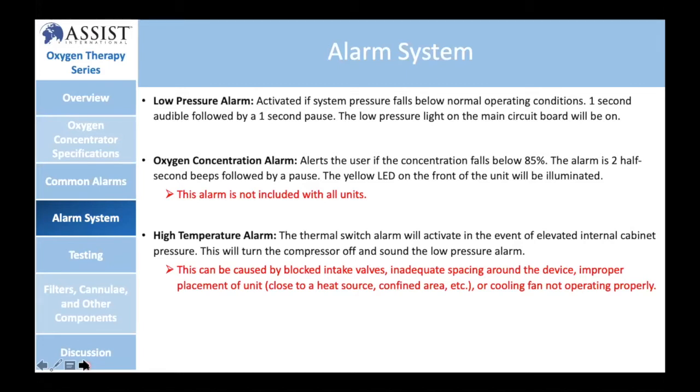There's a high temperature alarm, and the thermal switch alarm will activate in the event of an elevated internal cabinet pressure or temperature. And this will turn the compressor off and sound the alarm. It'll be similar to the low pressure alarm.